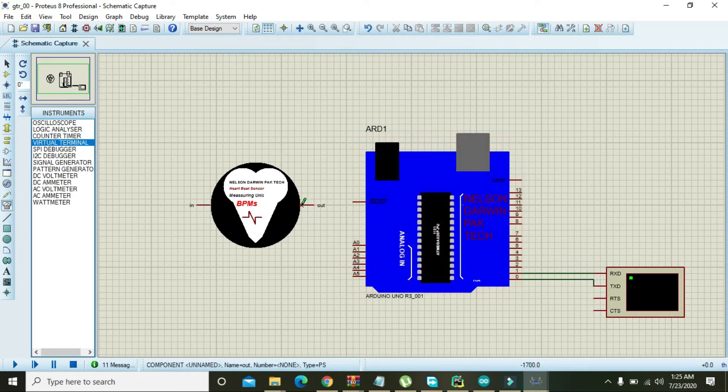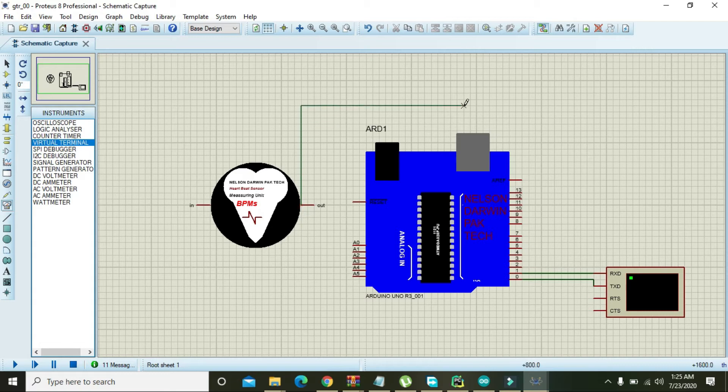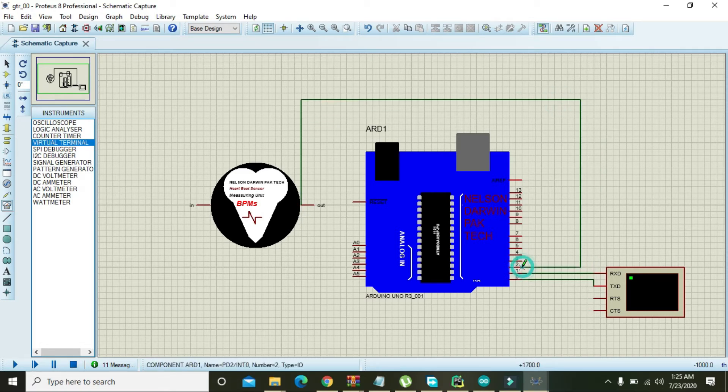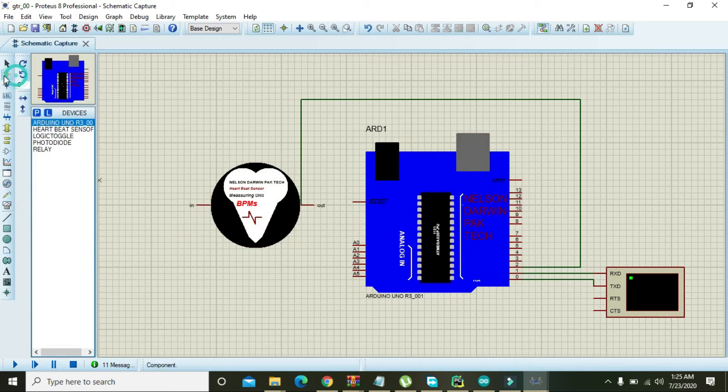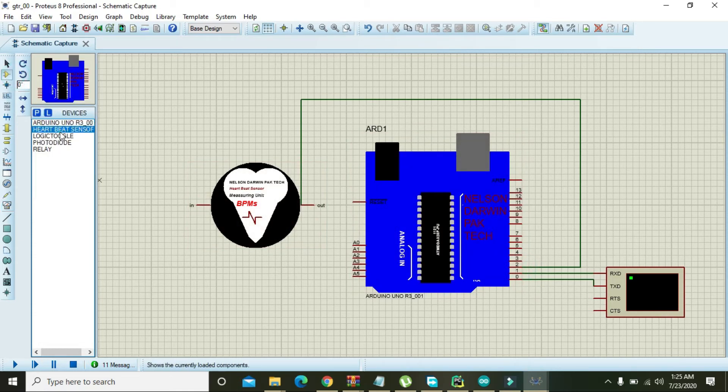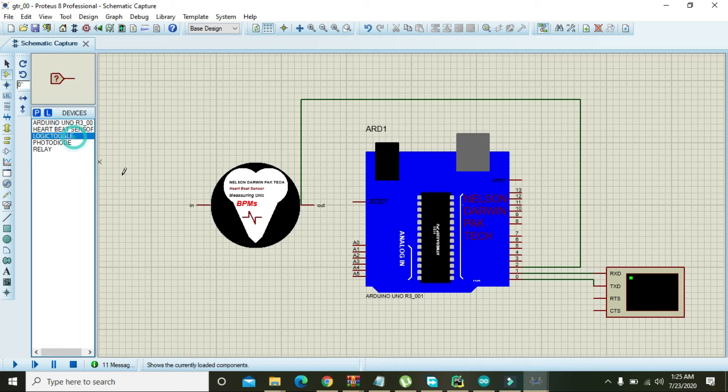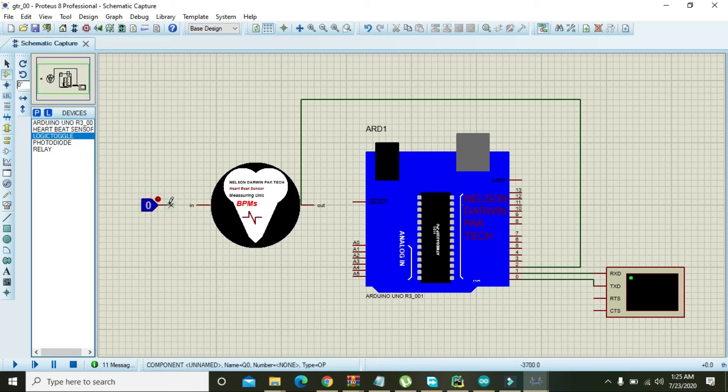Again, you need to connect output pin of the sensor to the pin number two of Arduino, and also take logic toggle and attach it here.